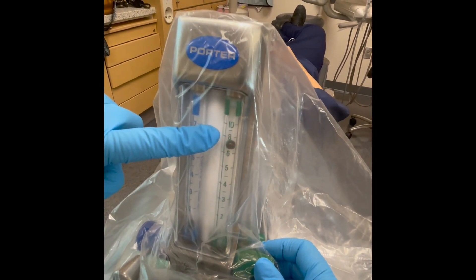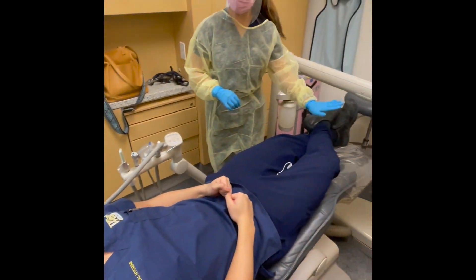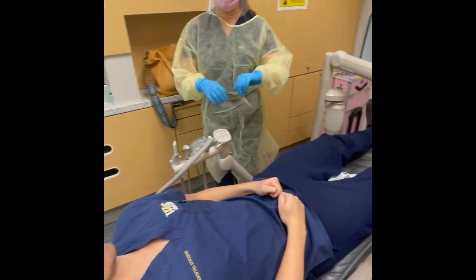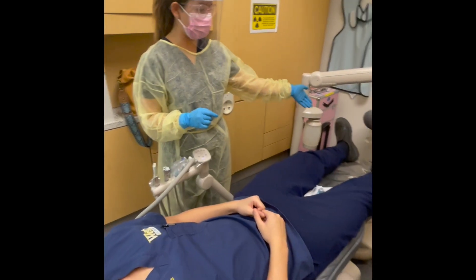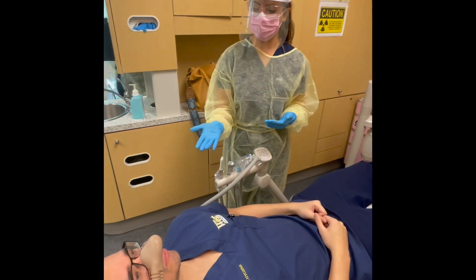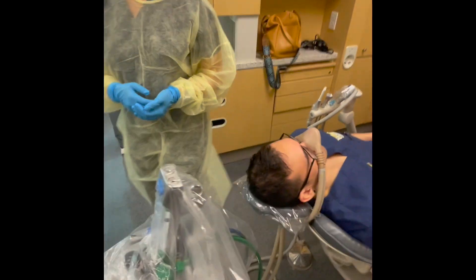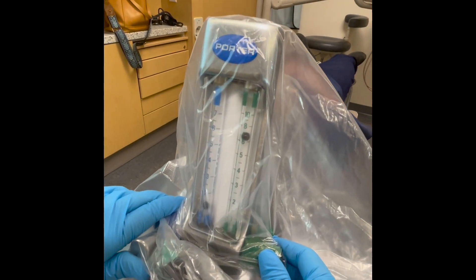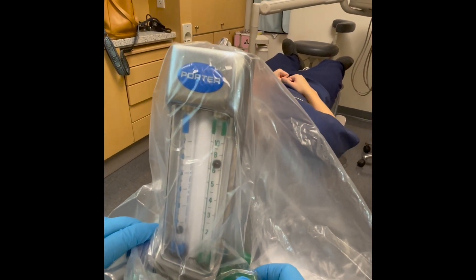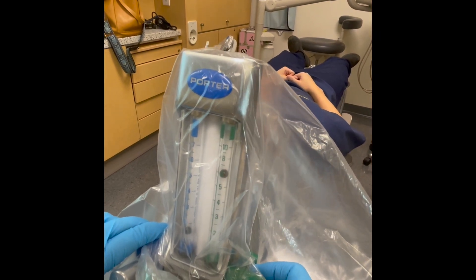Now you are ready to begin titrations — take note of the time. Begin with 1 liter per minute of nitrous, then bring oxygen down by 1, maintaining the tidal volume of 8 liters per minute. Ensure your patient's legs are uncrossed and their arms are placed either at their sides or in their lap. Observe them for signs of sedation and ask open-ended questions. If they tell you they don't feel any different, titrate again, this time increasing nitrous by 0.5 and decreasing oxygen by 0.5.